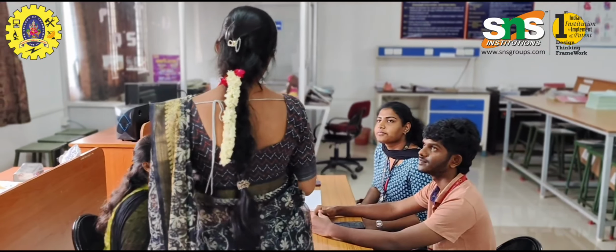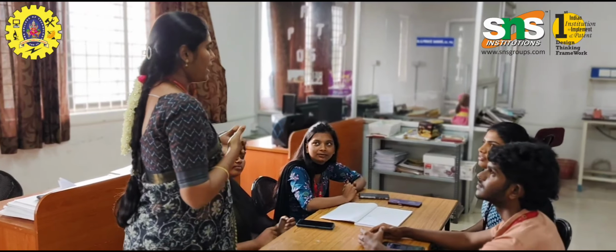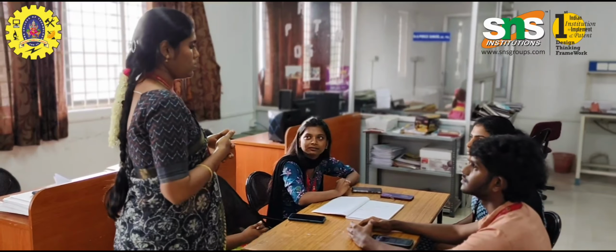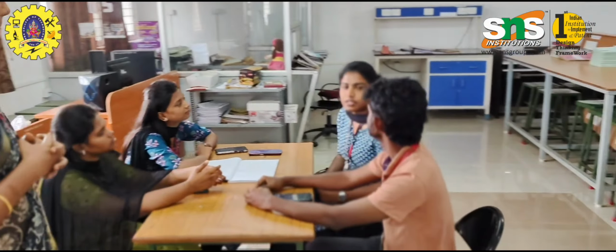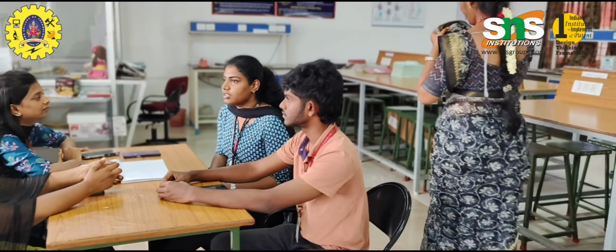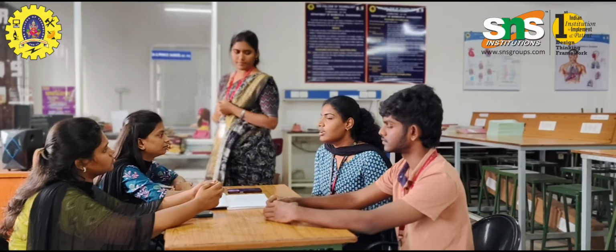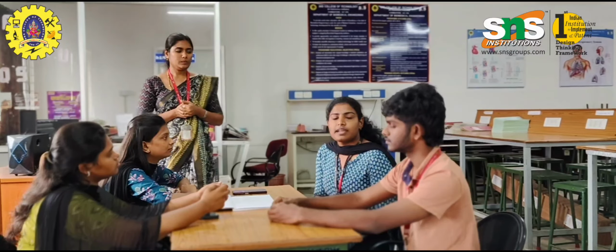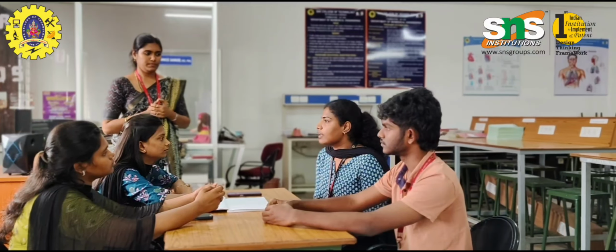Yes, ma'am. What is the title of today's topic? Electrosurgical. Can anyone tell us what is meant by electrosurgical machine, that is ESU? The ESU, electrosurgical unit, is a medical device which is used in surgeries to cut the tissues and control bleeding by using a high frequency current. It works by delivering radio frequency energy by using an active electrode.